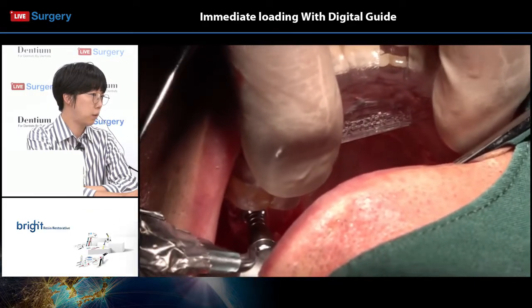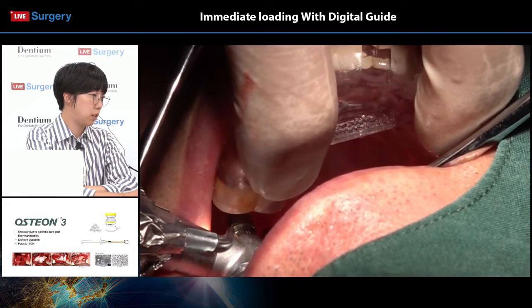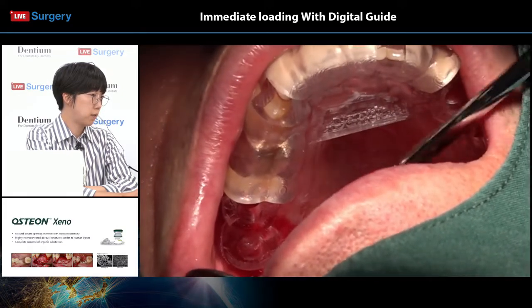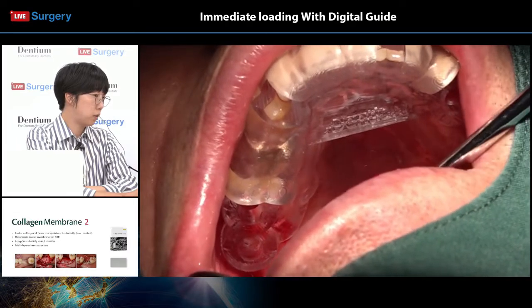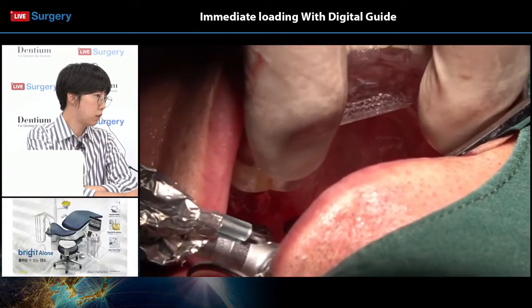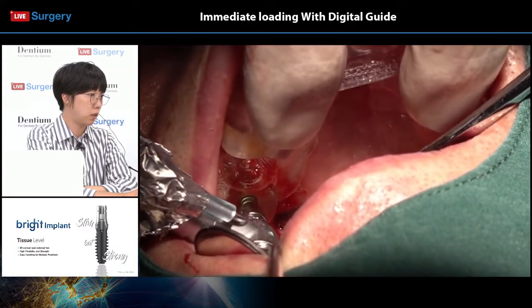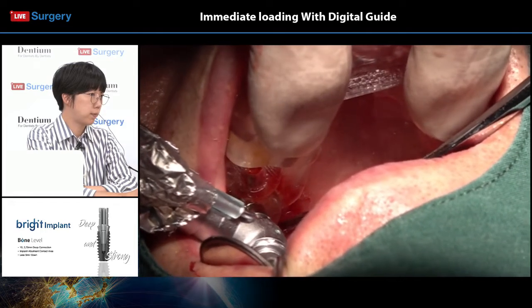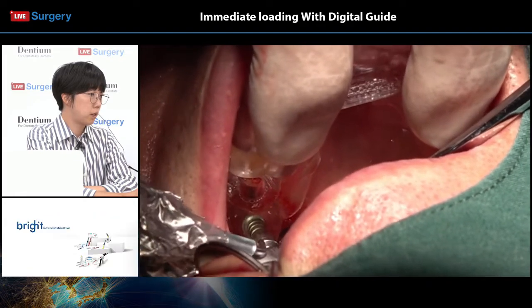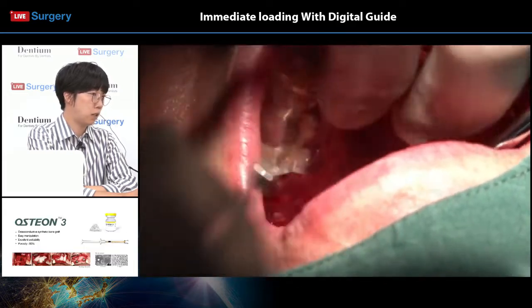Okay, Dr. Lee, after preparing the sites, he is trying to place the implant in the number 16 area. I believe he has planned to use implants with diameter 5.0 and a length of 8 millimeters. He is withdrawing because the implant cannot be placed in the area he wanted it to be in.